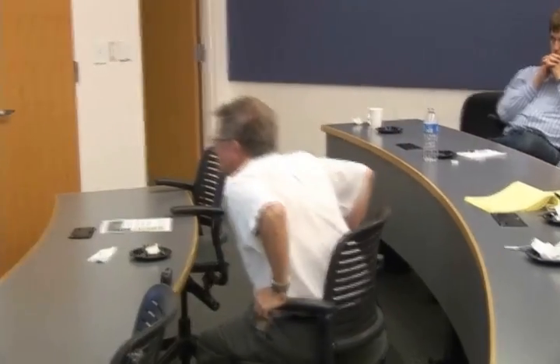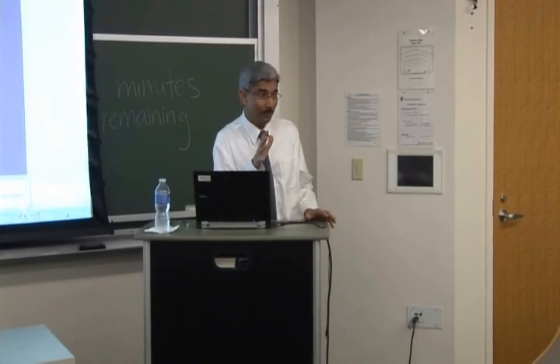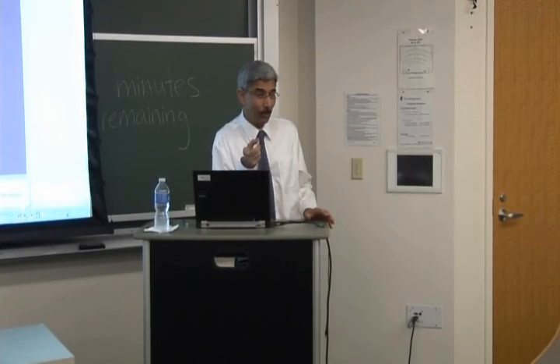Now, as far as I know, in PROSPECT, the original PROSPECT, echo also didn't win very high marks. The reason it did not win high marks is that they did not predict rightly the degree of remodeling. So it was long term. But in the short term, when you are going to select patients and see who is going to respond to your acute CRT, it was good. And those were the 3 parameters I mentioned.